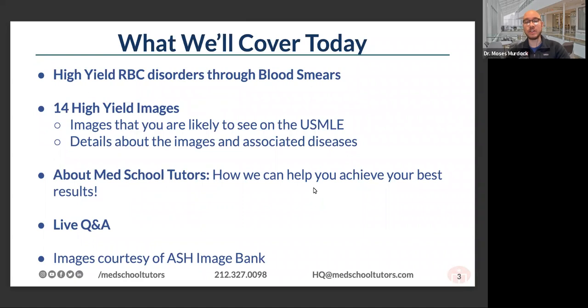A word on what we'll cover today. Really, the focus is going to be on high-yield erythrocyte or RBC disorders through one of the prettiest and also most informative tests that we perform, which is looking at blood smears under a microscope. We'll do this in a case-based format using 14 high-yield images. These are images that I think are likely to show up on your exams, and I'll give you the context around the images so that you can answer those basic science questions, associate the image with the disease, and get you those points that you need.